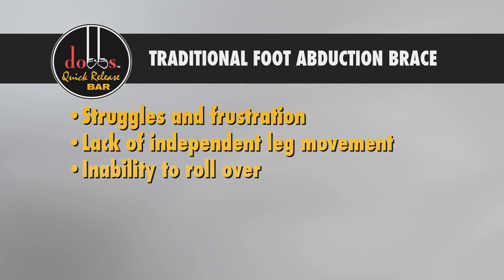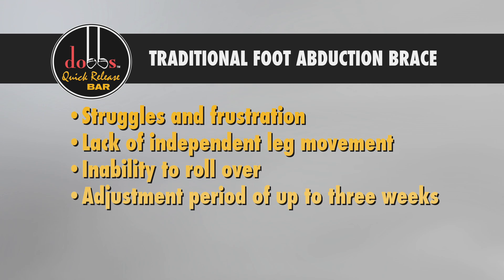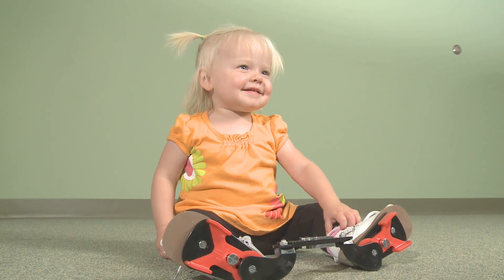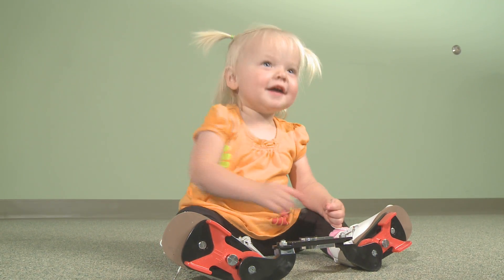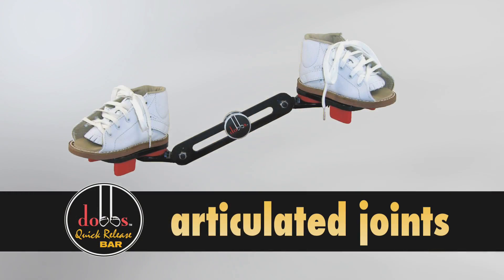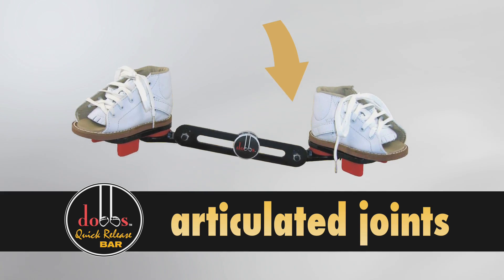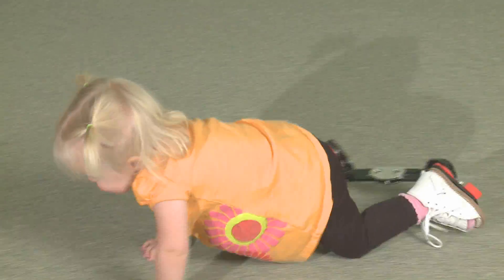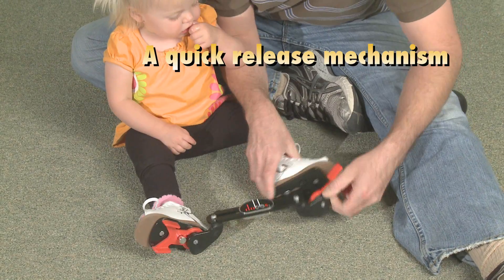This usually results in an adjustment period of up to three weeks while your child gets used to the brace, and a lot of sleepless nights for parents. The Dobbs Bar allows you to skip the sleepless nights and reduces the break-in period. The joints articulate, allowing the legs to move independently while holding the foot in the correct alignment, while also providing the child the ability to crawl, bend at the knees and stand in the brace.